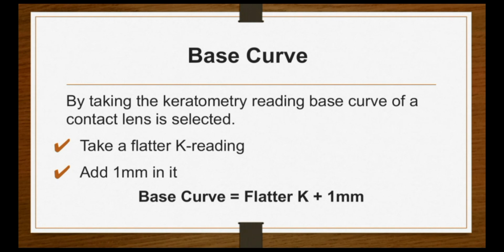7.8 millimeter is the average or normal value of the radius of curvature. But less than 7.8 millimeter shows that the cornea is steeper, meaning the patient is turning toward myopia, and greater than 7.8 millimeter states that the patient's cornea is flatter. So the values that are larger will be the flatter ones in millimeters, right?